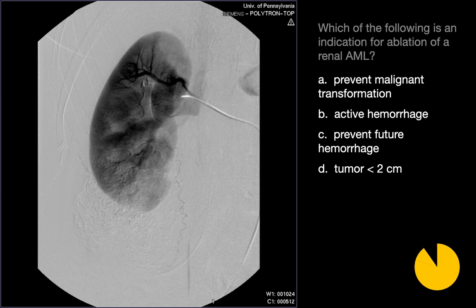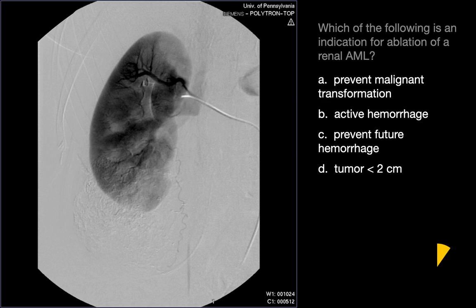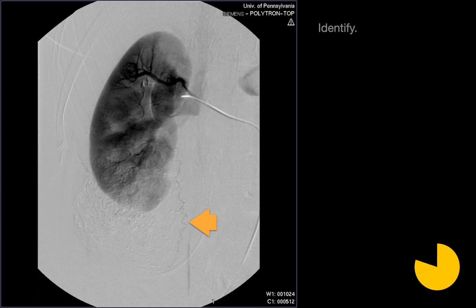The best indication for ablation of a renal AML is preventing future hemorrhage. The primary indication for treating AML is to decrease the risk of future hemorrhage. Heat-based ablation is preferred because of the associated cautery effect. The structure identified in this case is a vessel, specifically the ureteral artery.